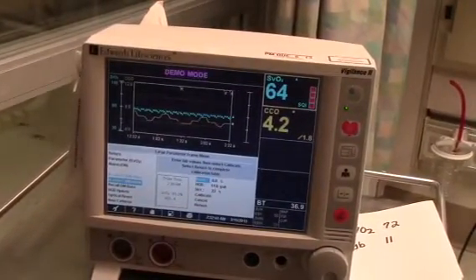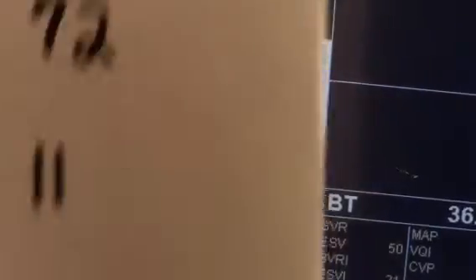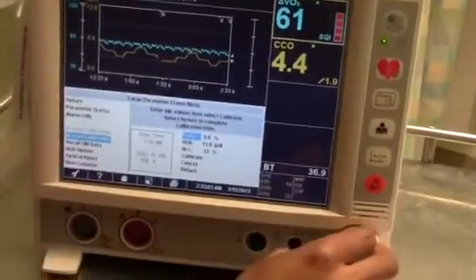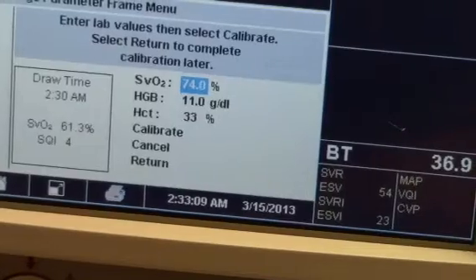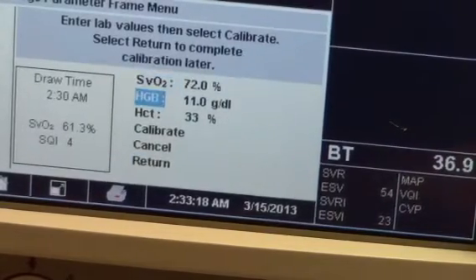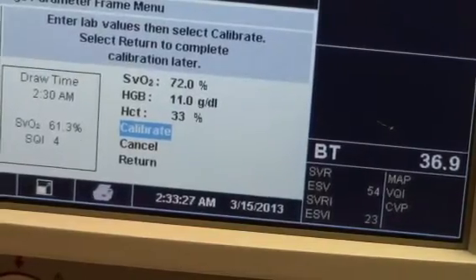After obtaining the most recent venous blood gas and hematocrit hemoglobin results, use the navigation knob to enter the SVO2 or SCVO2 value from the venous blood gas result and the hematocrit hemoglobin sample. Finally, use the navigation knob to select and press Calibrate.